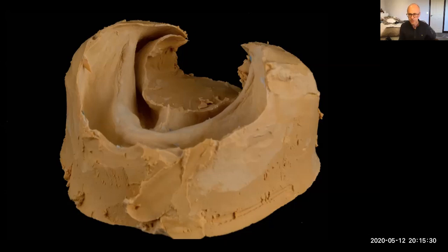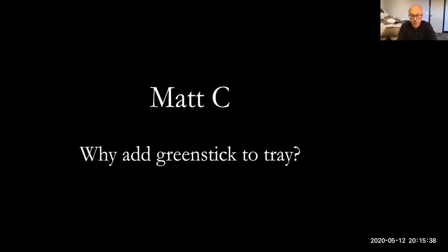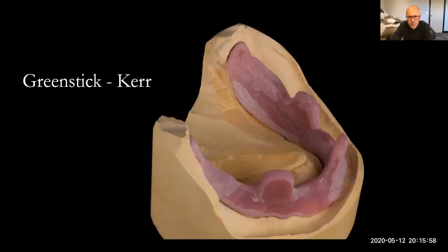And this brings me to another great question, which Matt asked me via YouTube, actually. He'd seen one of the webinar videos, and he said, if we have a really superbly done primary impression, why can't we just make the denture on that? What's the point in having this tray that we border mold? Can't we just make it from the primary cast? Of course we could make it from the primary cast, but the denture will not fit as well.